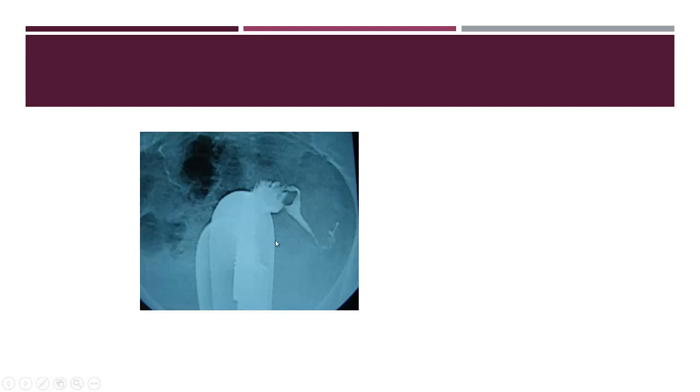What about this case? The uterus is in an abnormal position. Here, when we inject the cannula, I found that there is a capacious cervix. Here, the cervix is capacious. There are endometrial glands, and on doing ultrasound, this is a magnified view. This is not a normal cervix. This is the internal os, and the uterus appears in an abnormal position, pushed out by this cervical lesion.